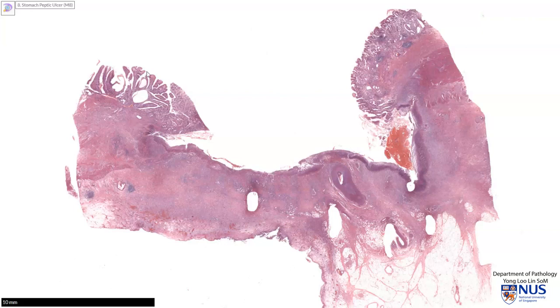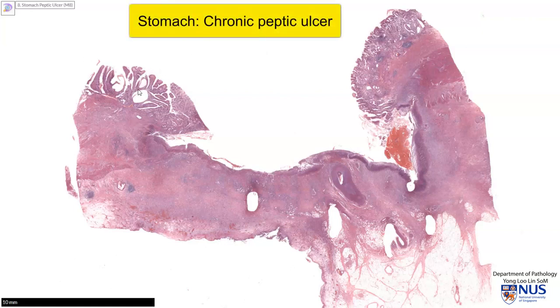This is a virtual microscopy slide of a chronic peptic ulcer. Here on the left and on the right, we are looking at the intact gastric mucosa.